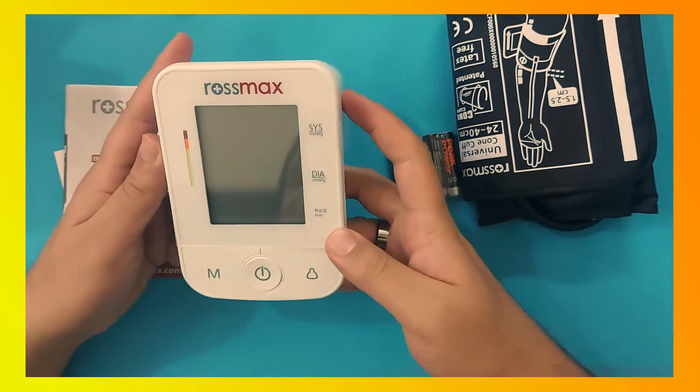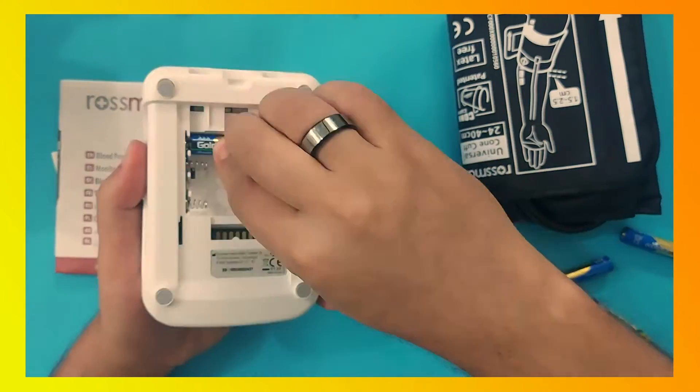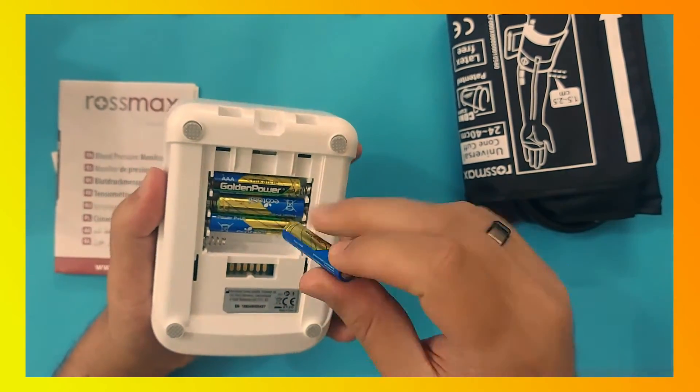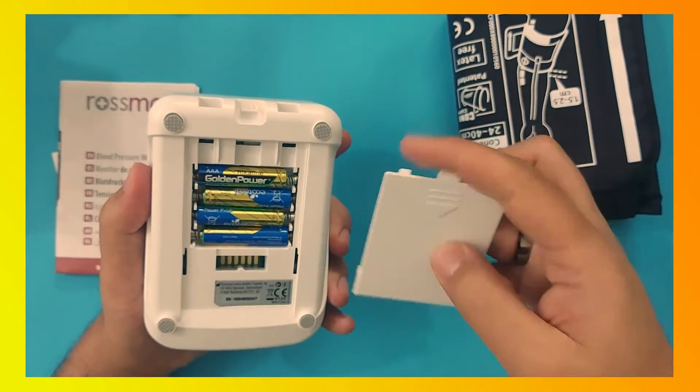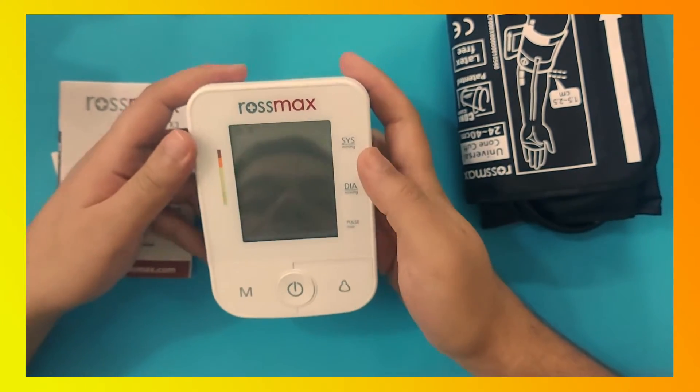First, you have to install the batteries according to the plus and minus sign, as you can see in the video clearly. Install the battery and close the back flip. Now the setting will appear on the screen.